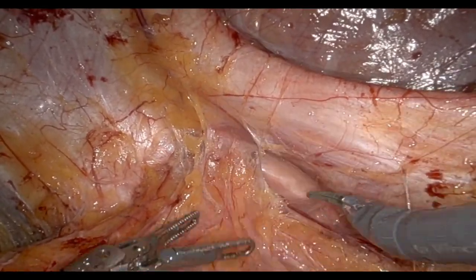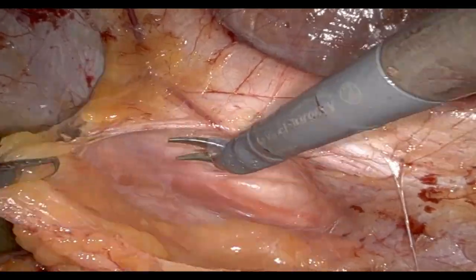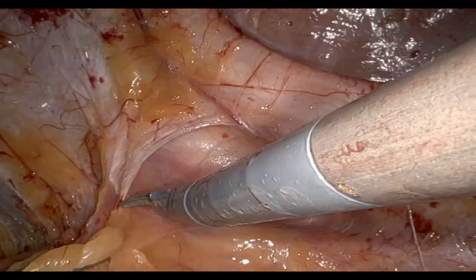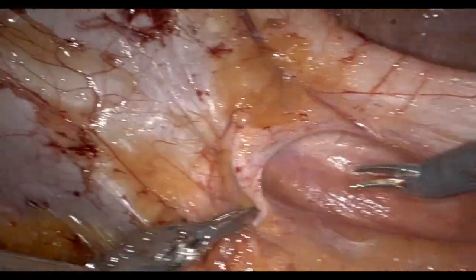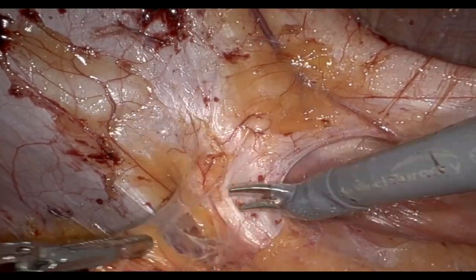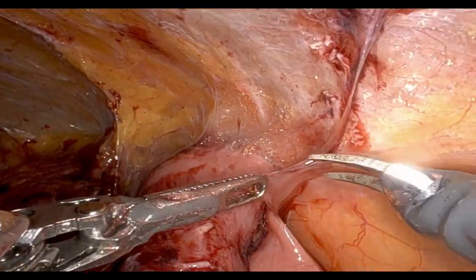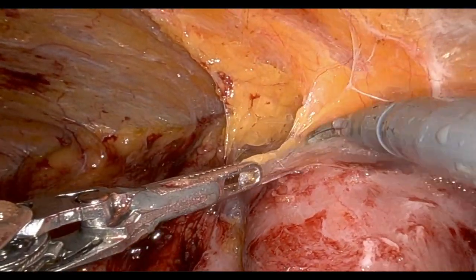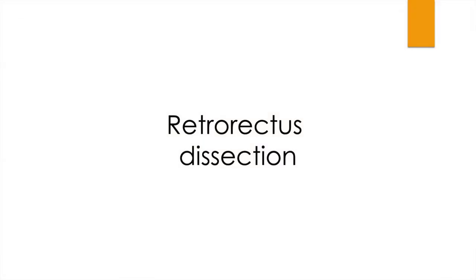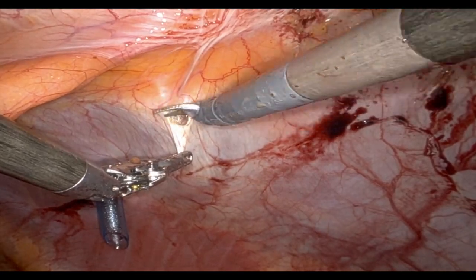We continued with dissection. That was the first hernia. This is the peristomal or prior stoma site that was also somewhat of a hernia. We carried this dissection all the way to the lateral sidewall — again showing the importance of reviewing your anatomy on CT and identifying all areas of adhesions. She was having obstructive symptoms at baseline, so we took down all adhesions and ensured there were no other sources or lead points of obstruction before moving forward with retrorectus dissection.